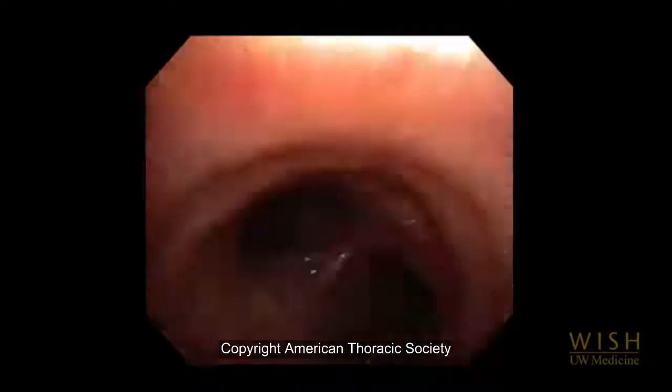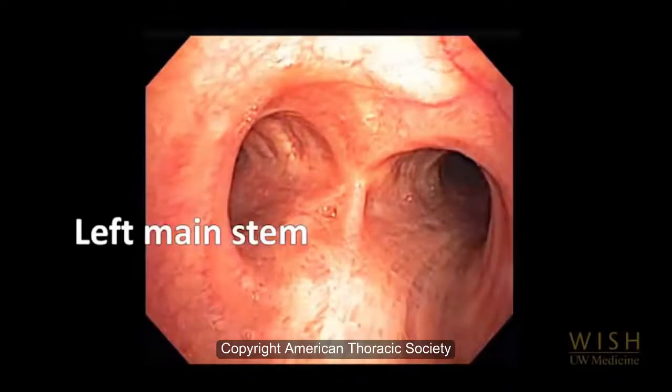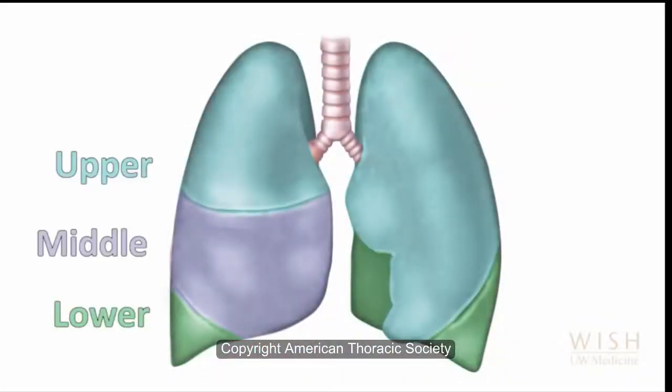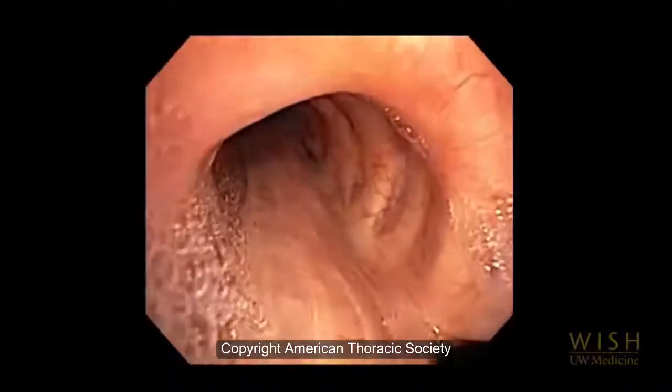Lidocaine is administered at the main carina prior to advancing into the mainstem bronchi. The main carina should be sharp. The left mainstem typically branches off at a slightly more acute angle than the right mainstem. The right lung has 3 lobes, upper, middle, and lower. The left has only 2, upper and lower. The bronchoscope is entering the left mainstem.